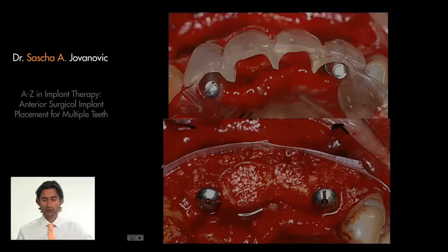You can see the surgical guide stent, which is helping us to place the implants in the optimal position. You can see how in the 2 central incisor areas, bone graft material is utilized to augment the site with the purpose to have more foundation for the pontics. And the 2 implants also had some bone deficiency, so they were grafted as well to thicken the bone.